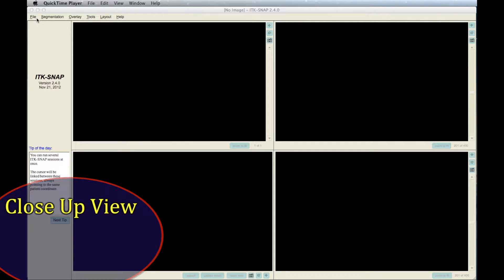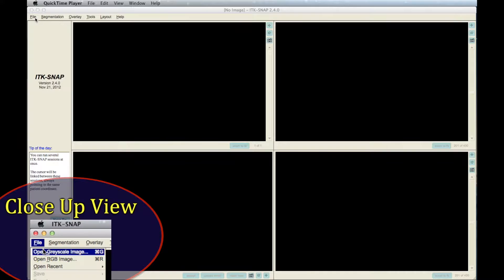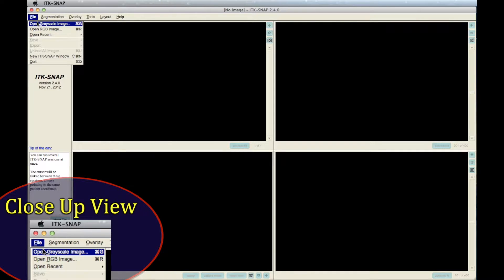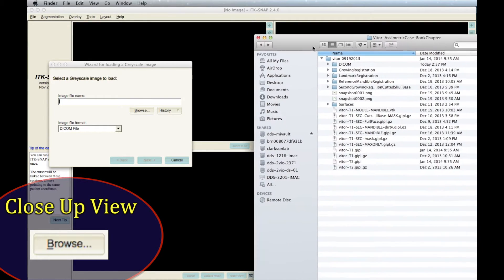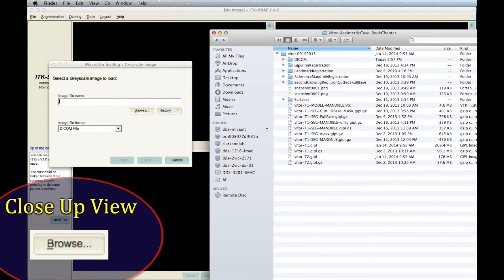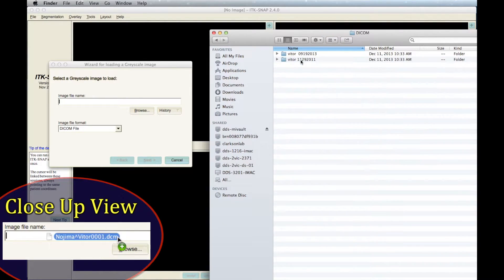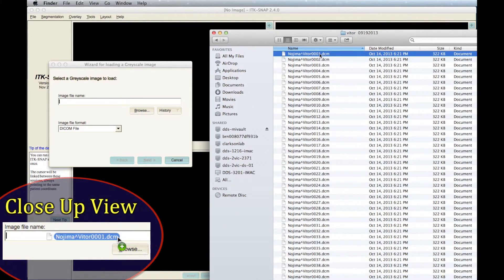To load a DICOM image, go to File and then select Open Grayscale Image. Search for the folder where your DICOM sequence is located. Select the DICOM files and click Open. Or, you could drag and drop the DICOM file into Image File Name.